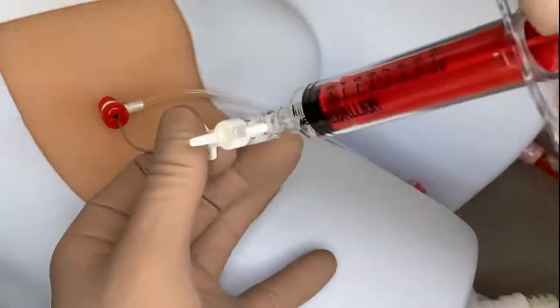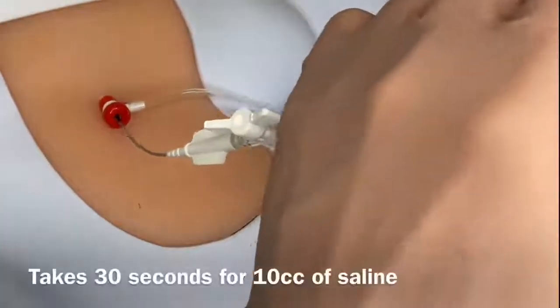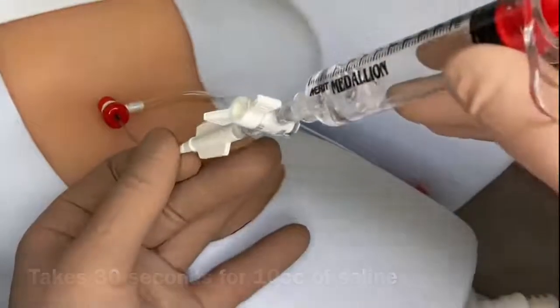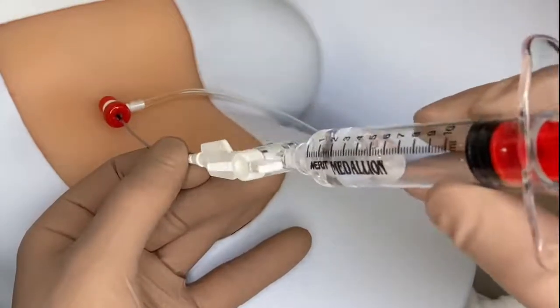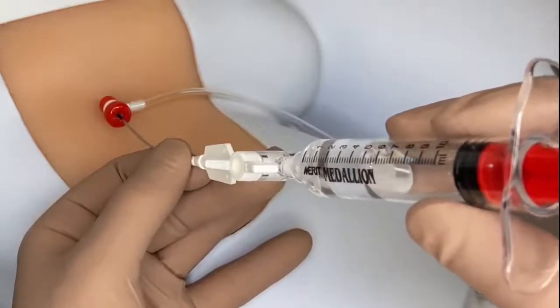To completely deflate the balloon, draw back fully on the syringe. Maintain suction on the syringe until the balloon is completely deflated. The device is designed to allow for slow deflation to help avoid hypotension. Ensure that the balloon is completely deflated before removal.